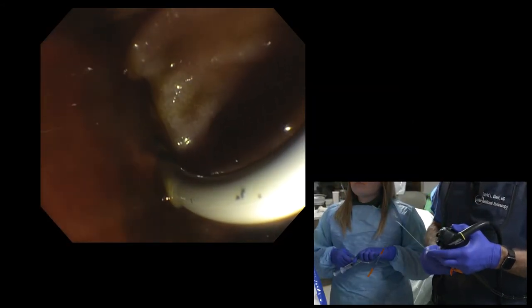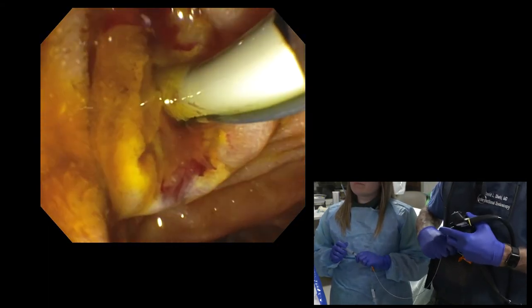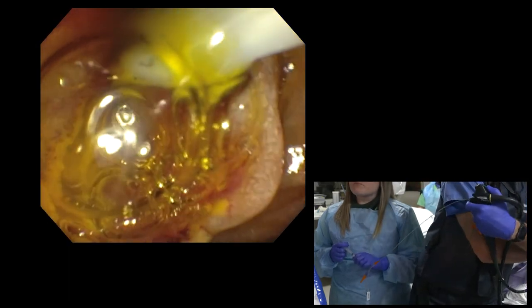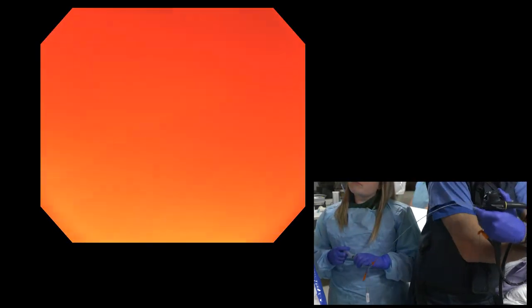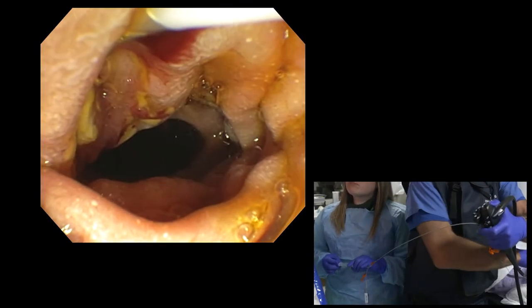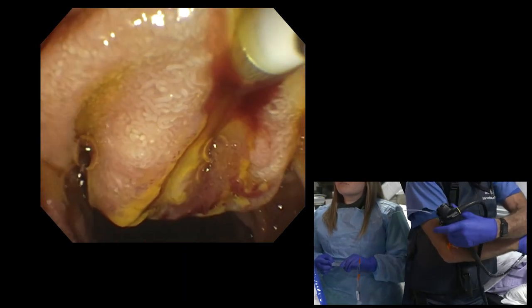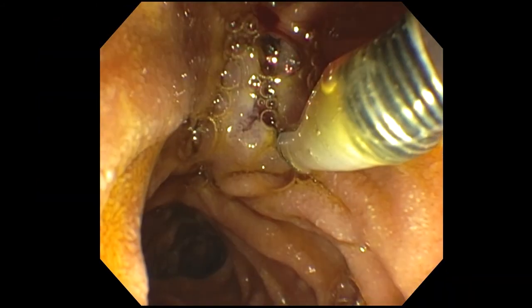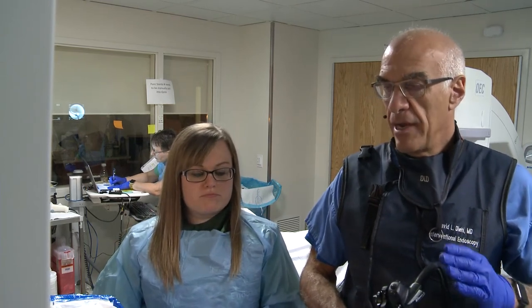And then the final sweep here. We will give her rectal indomethacin. We've given her lactated ringers, but the procedure went without any issues. So I think her risk of post-ERCP pancreatitis is standard, which is to say three to five percent.